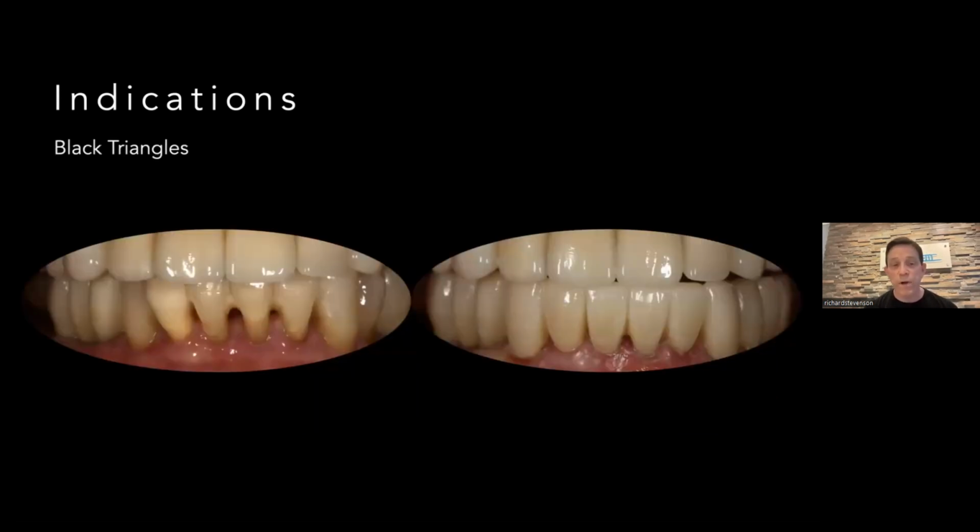And then here's another one, this is a perio-pros rehabilitation. I did not do the upper teeth, but I inherited this case and she hated the way this looked on the lower. So I actually used veneers on those lower teeth to blend into her existing restorations. And I think in terms of blending with the existing, Sam Alawi did a beautiful job. And I think we're really in good shape with this result, but these were done as super veneers, really wrapping around the teeth significantly.